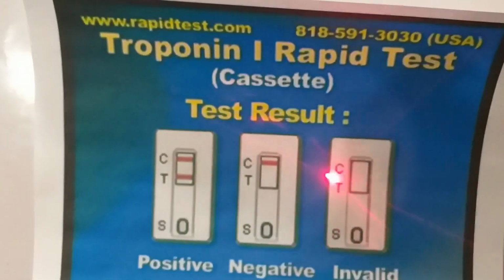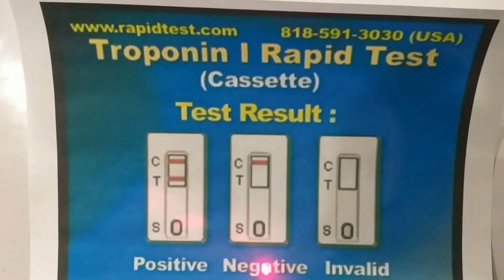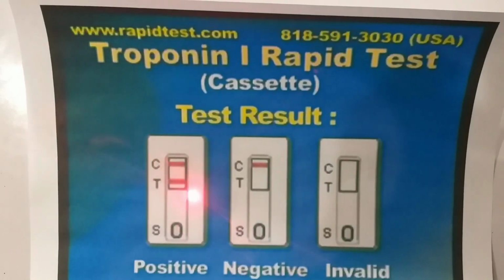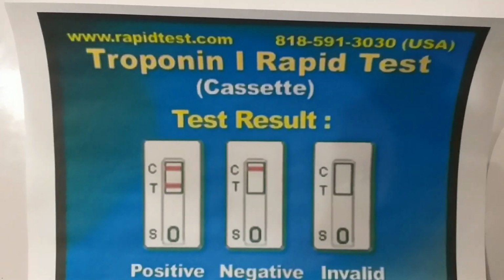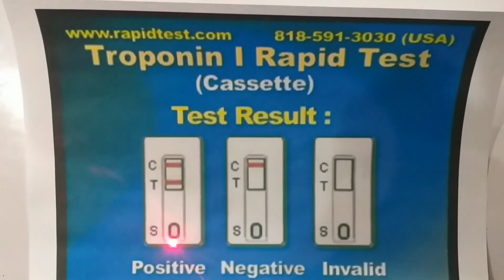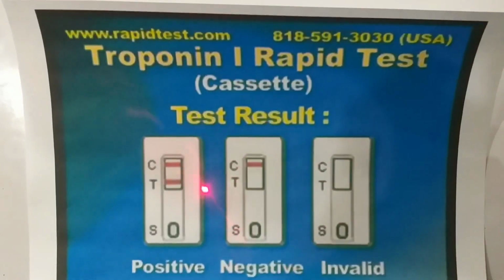There, when there is no line present, it is known as invalid. And when the control is present and the test is negative, this is a negative test. When both control and test, the red line, are present, this is positive. Here you drop the blood. This test comes with an included syringe. So you take 3 ml of the blood, then you put the drops over here, and it takes only 15 minutes for the test to be either negative or positive.